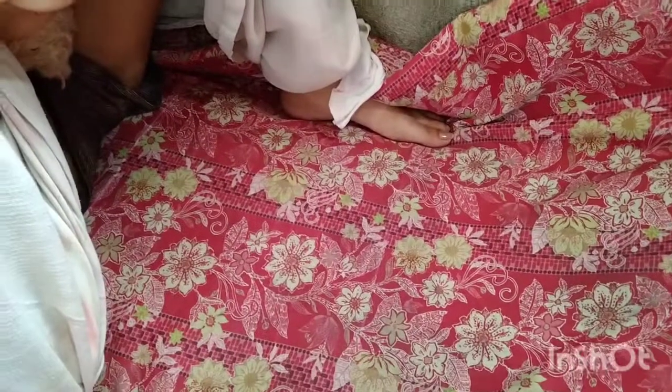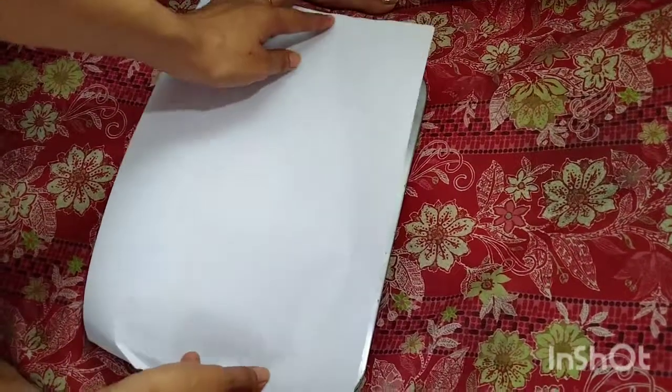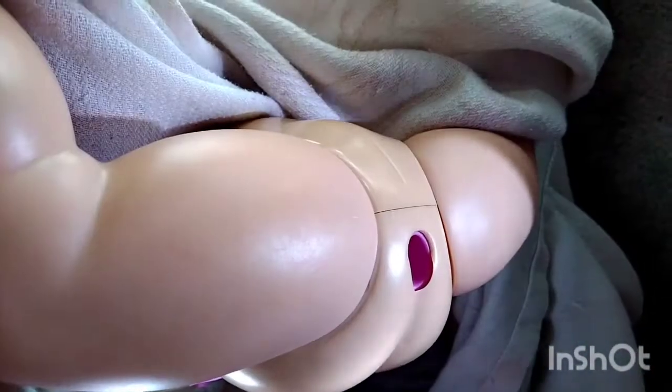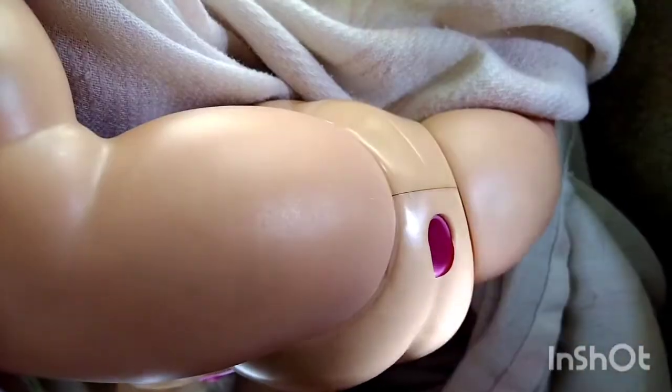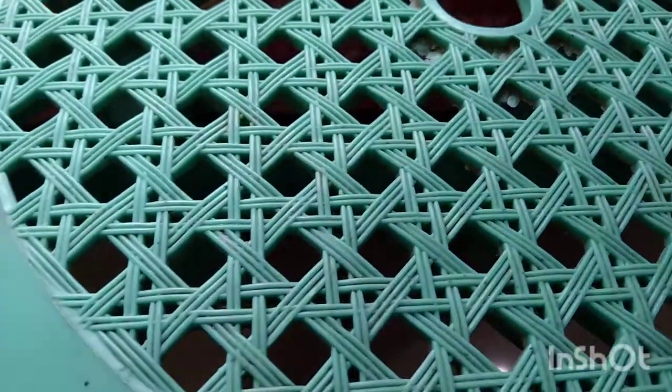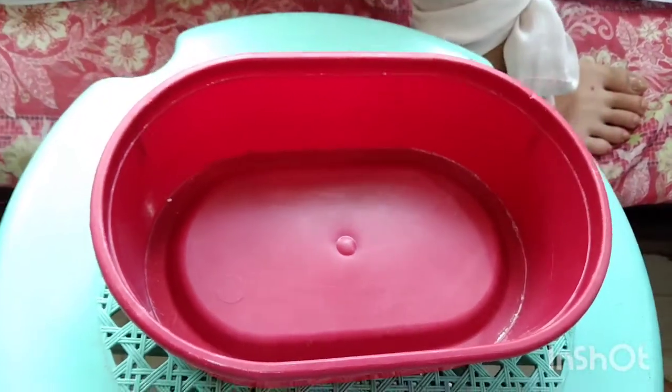Step number 7 is to place tray between thighs facing foot of the bed. This provides easy access to supplies during catheter insertion. Next is to adjust drop light. Flashlight may be used. This permits accurate identification and good view of the urethral meatus. After that, place waste receptacle at an area near you. After that is to wash your hands because this prevents the spread of microorganisms.